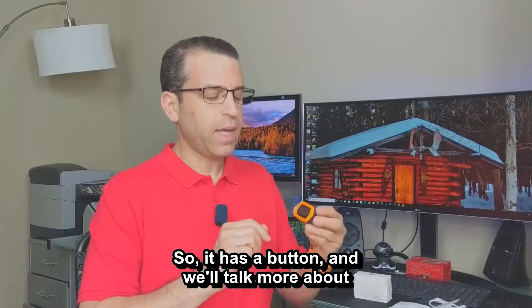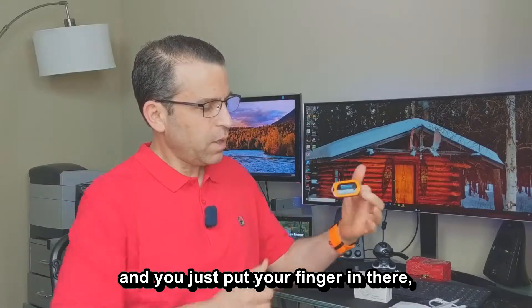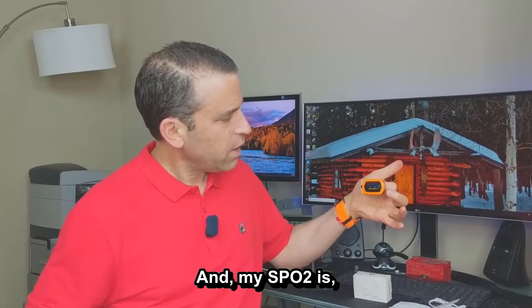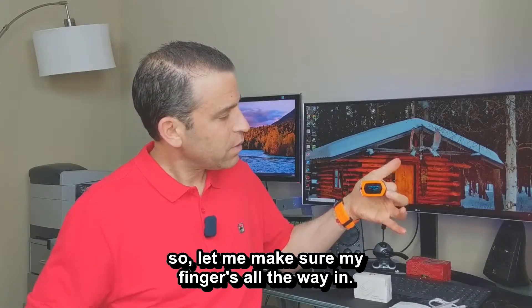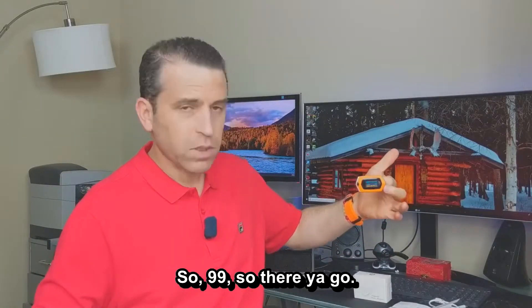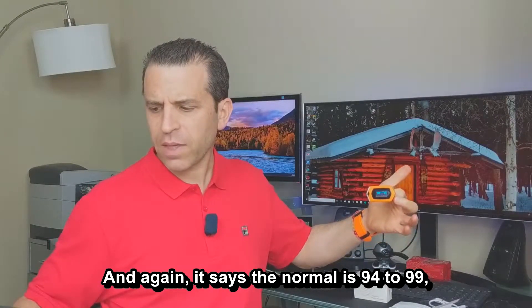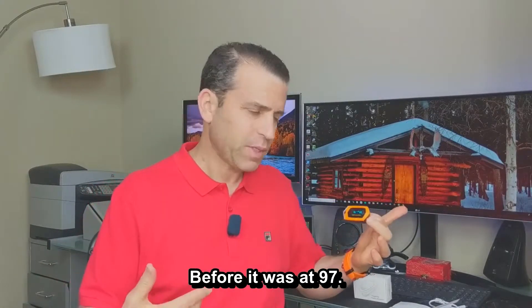So let's see what mine is. There's a power button — you just put your finger in and it takes about 10 seconds to read. Let me make sure my finger's all the way in. It has a graph too, which is very cool — it shows your heartbeat. So 99! The normal is 94 to 99, so right now it's at 99, and before it was at 97.